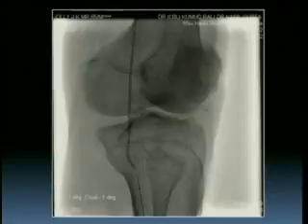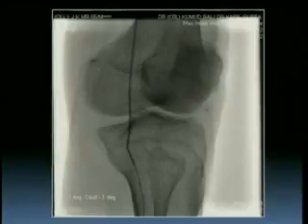So we have just reached up to the origin of the PTA, or the distal part of the TP trunk, which we then recanalized, and now we have entered into the popliteal artery. So this is the angiogram that we finally obtained after recanalization. And then the way is to thread this wire across the catheter and bring the wire end out from the groin.